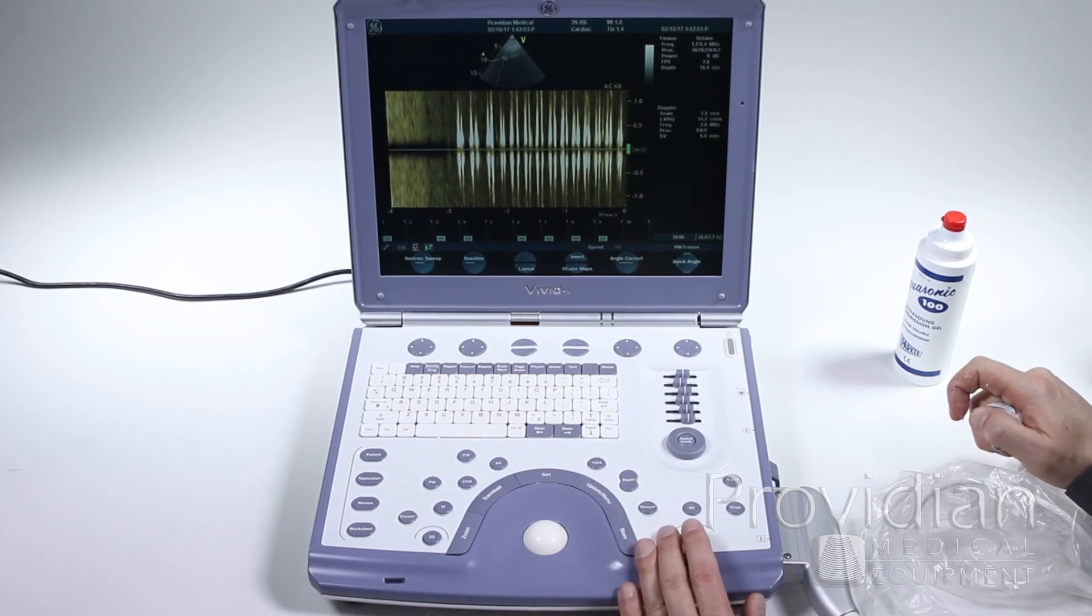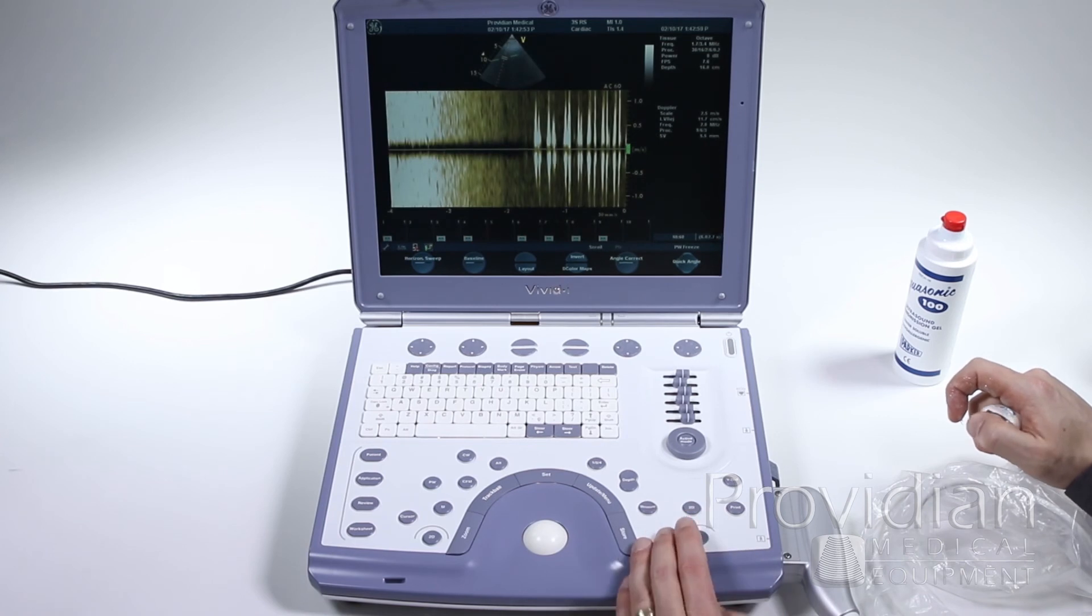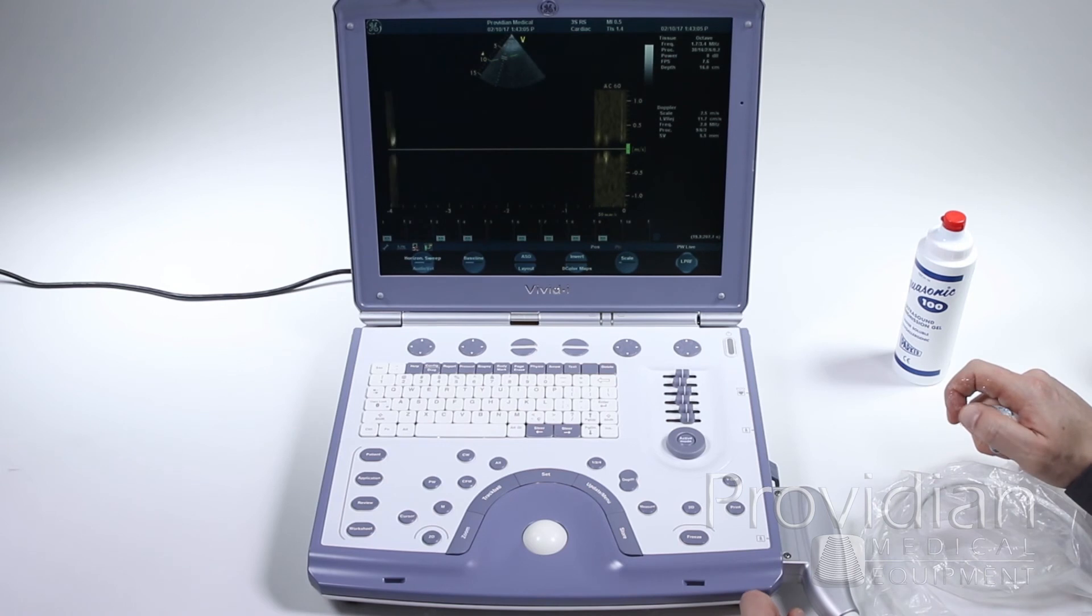Freeze and I've got them all. Again, I can hit that 2D to freeze. If I've got the entire thing frozen, I can hit that to freeze and unfreeze the 2D. So these work independently of each other. If I unfreeze, it's going to give me that live spectral. And then I unfreeze the 2D, and so they're both live.